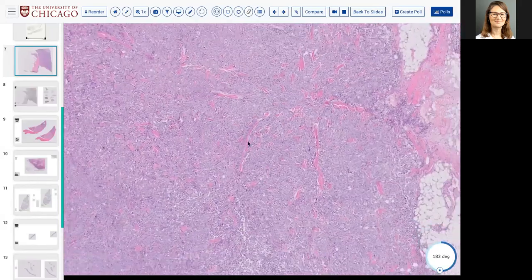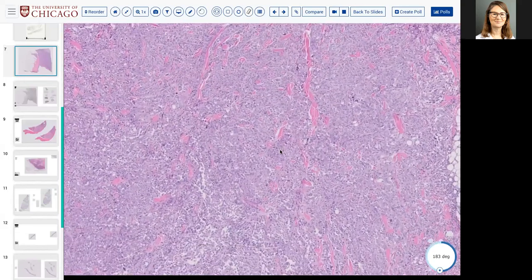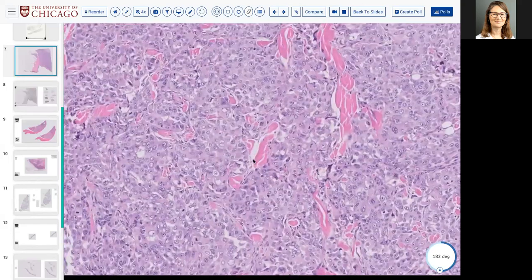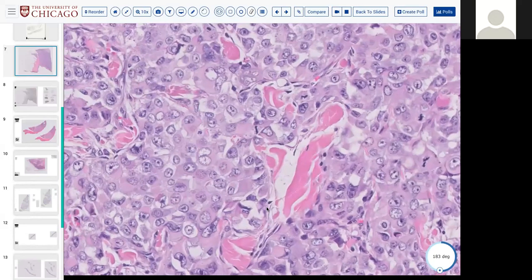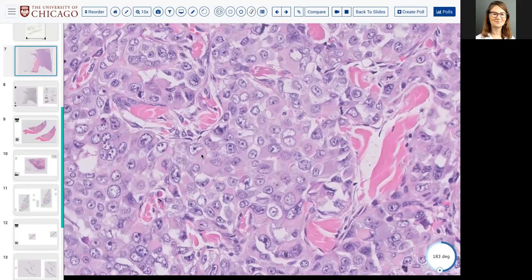Did anybody notice what few cells I was resting on? Here's a few. Pretty few giant cells. The little rhabdoid. Yeah, they have a little bit of a rhabdoid appearance, at least here, with a very vaguely pale, eccentric eosinophilic substance in some. Here. There. Yeah.